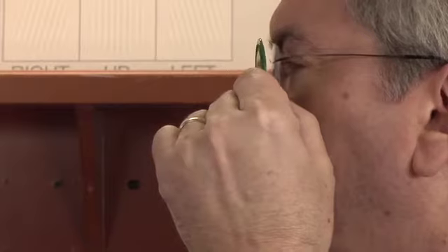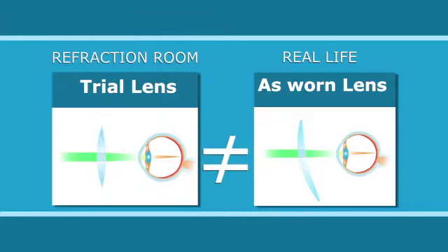This trial lens is purely spherical, biconvex or biconcave, and this trial lens is used centered in front of the eye without any tilt in front of the optical axis of the eye. On the other hand, the final lens delivered to the patient is different in terms of curve, and in front of the eye, with a different tilt, the conditions of wear are completely different compared to the zero tilt of the trial lens.